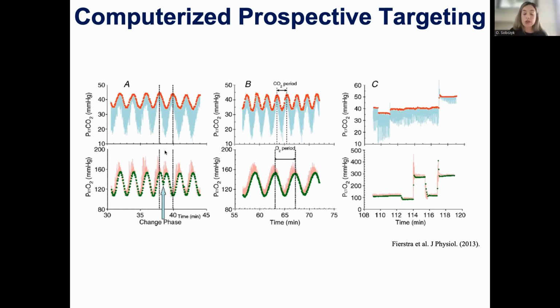There are disadvantages to this method too, and that includes equipment setup. There has to be user knowledge on how to use this device, so training is involved. And there are costs associated with acquiring and maintaining this device. Full disclosure, this is the method of delivering CO2 that we use in our lab.